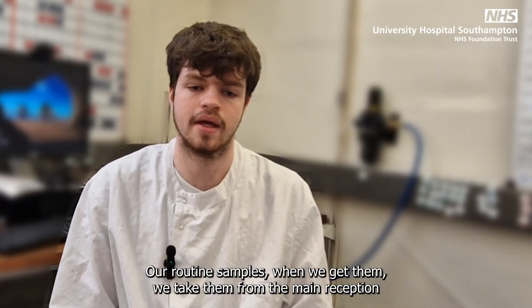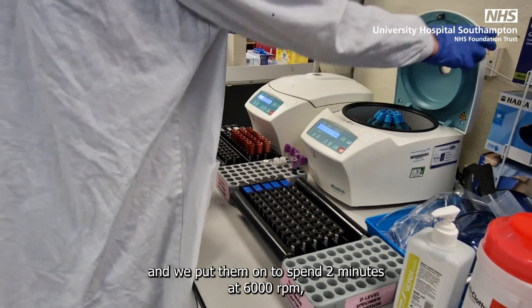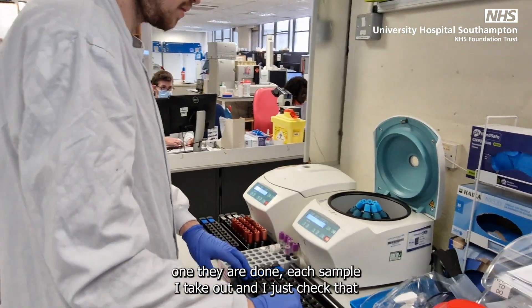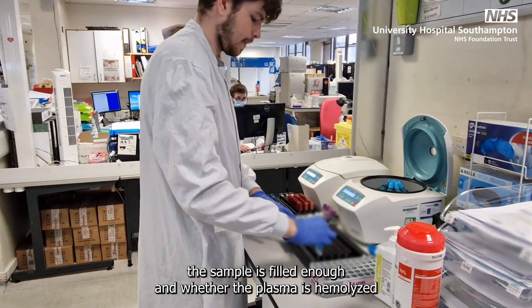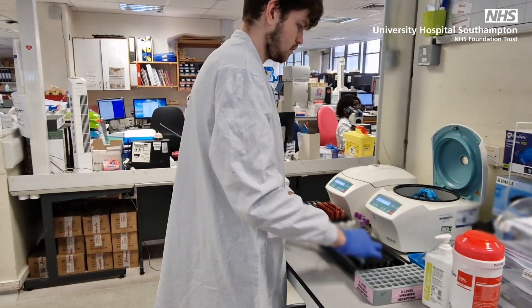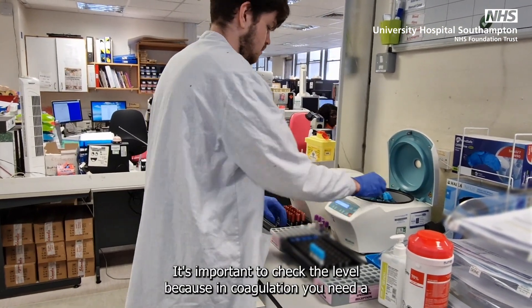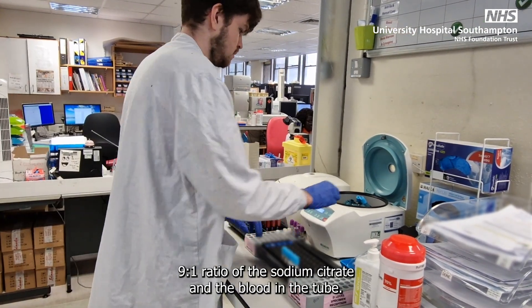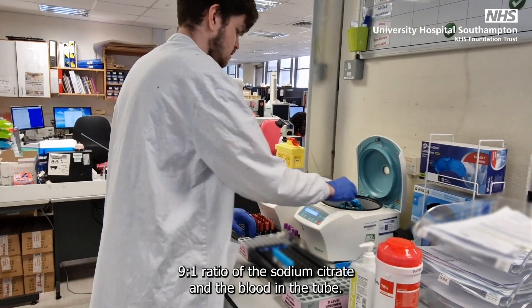Our routine samples, when we get them, we take them from the main reception and put them onto spin for two minutes at 6000 rpm. Once they're done, I take each sample out and check that the sample is filled enough and whether the plasma is hemolyzed — it's a measure of how red the plasma is. It's important to check the level, because in coagulation you need a 9 to 1 ratio of sodium citrate and blood in the tube.